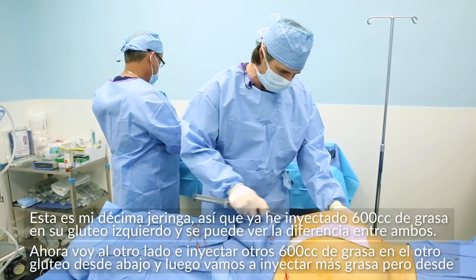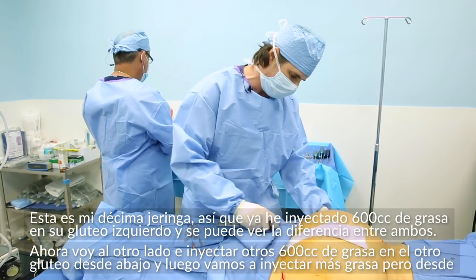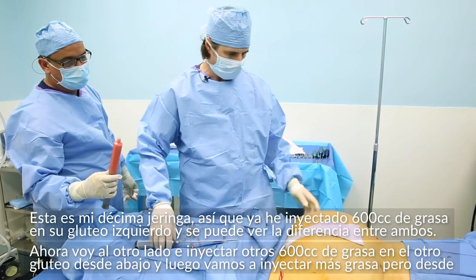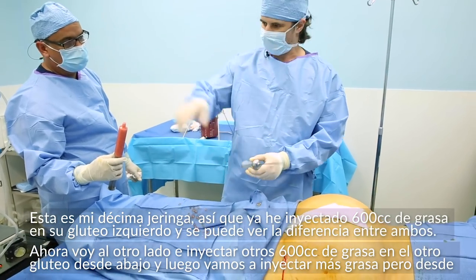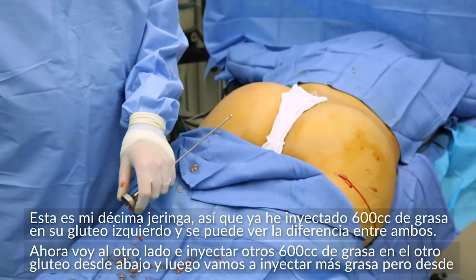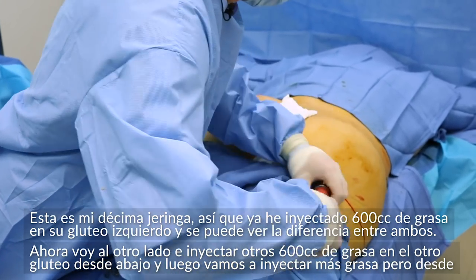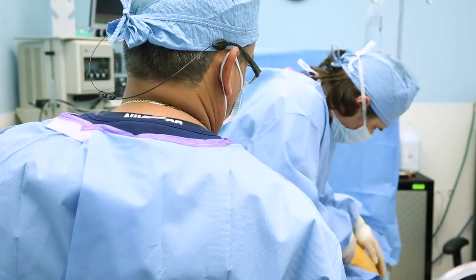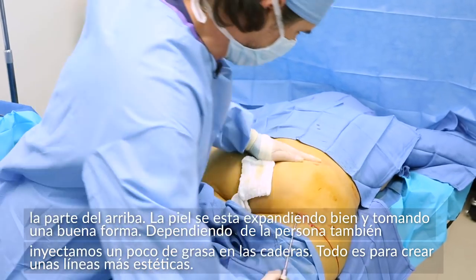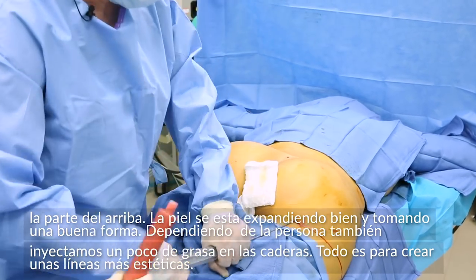This is my 10th syringe — I've already injected 600 cc's of fat into her left gluteal area. You can see — let's get a picture from the bottom to show the difference between the two sides. Now I'm going to go to the other side and inject another 10 syringes, or 600 cc's, and then come to the top and inject some more from another direction. She's expanding nicely and really getting a nice shape, which I'm very happy with.